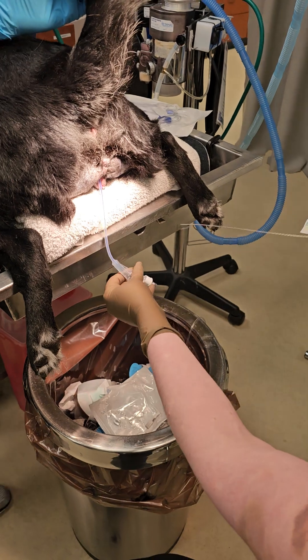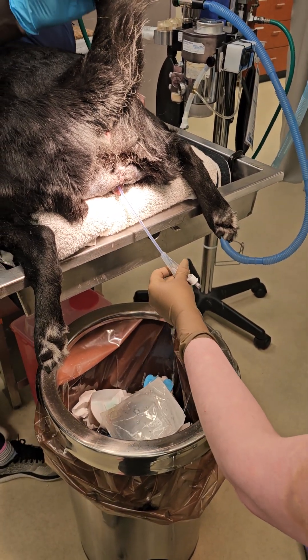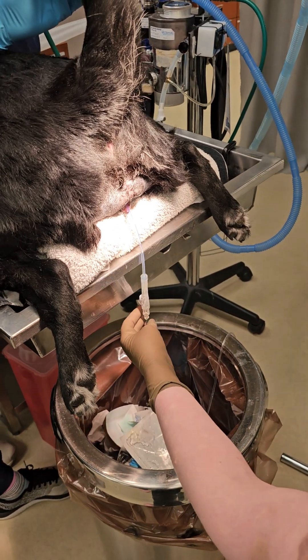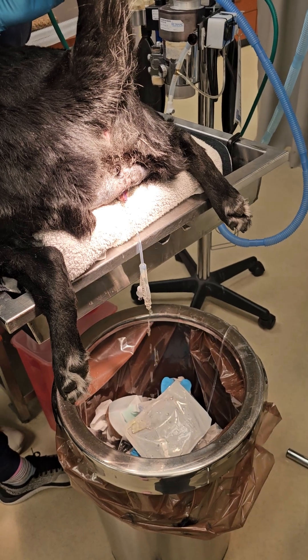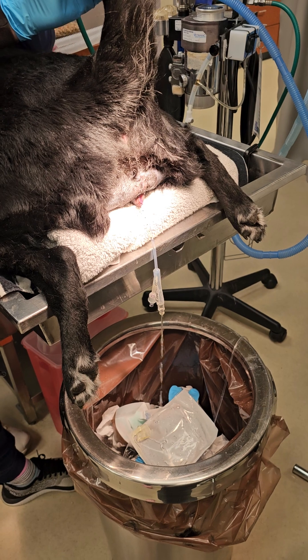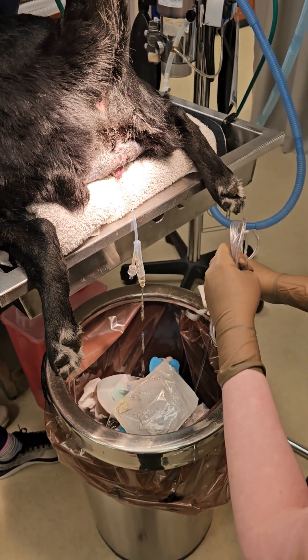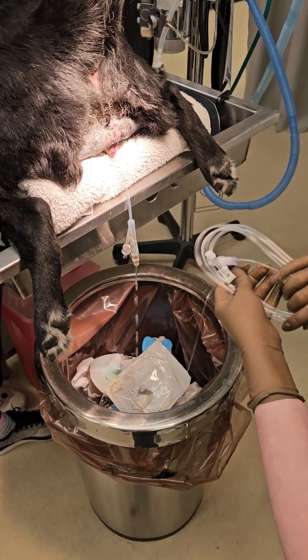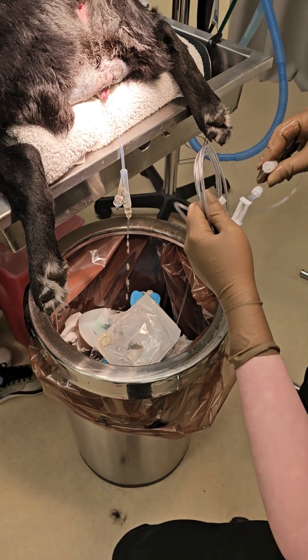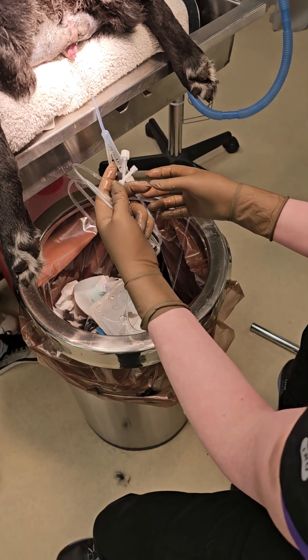Pull straight out, pull straight down. I already have my little adapter connected. Then they're going to open this up sterile for me — I'm hanging it for a second because it's sterile. You can also use that same adapter with sterile sub-q fluid tubing and a sterile used IV bag.